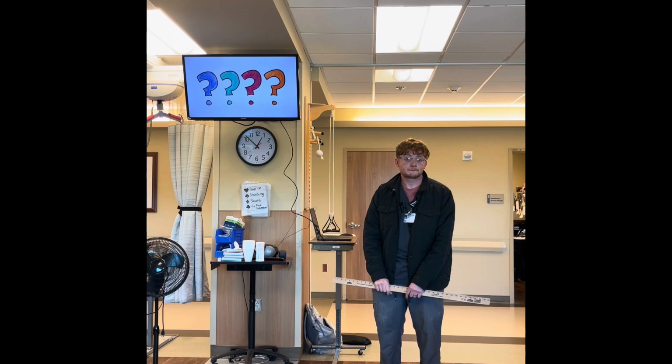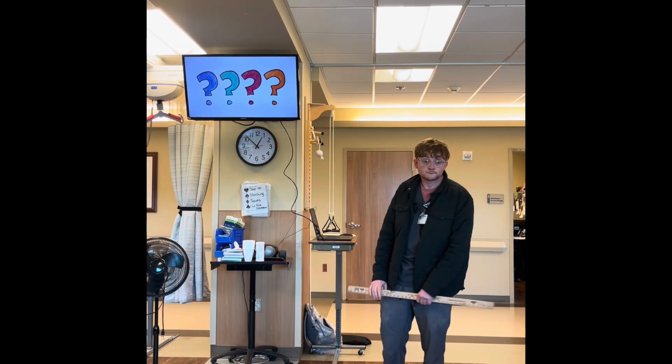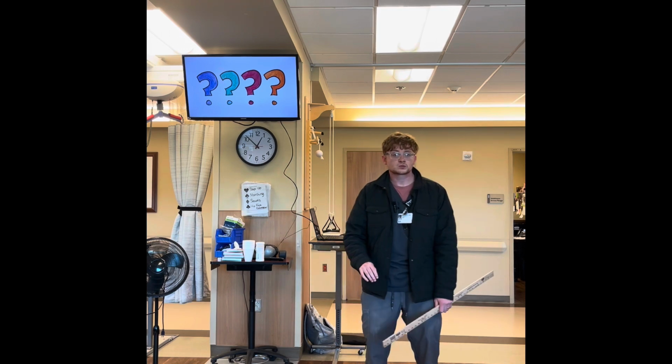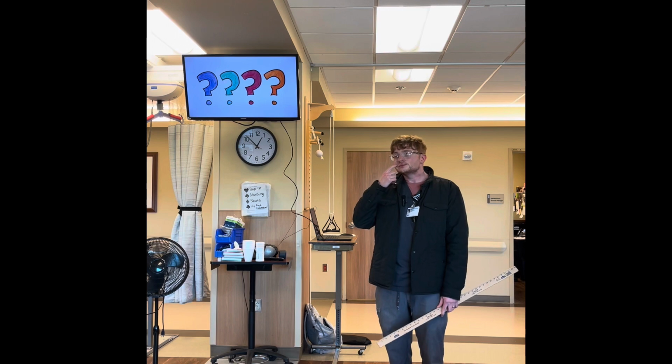What about to progress them on their diet? You could do another swallow test. Like if they do badly the first time, or if they have to be on extra thick liquids, but then you think they're doing better, you have to do another one to see it on everything.